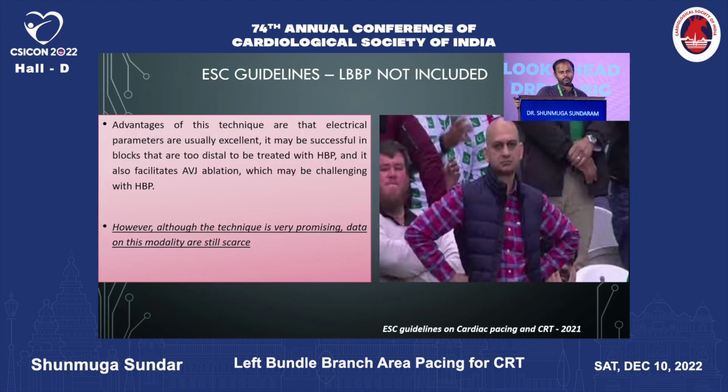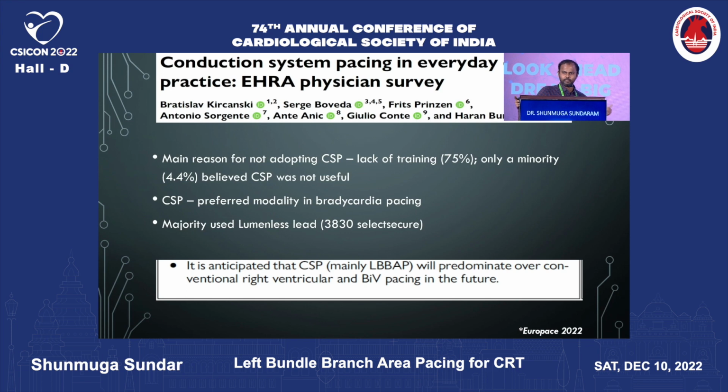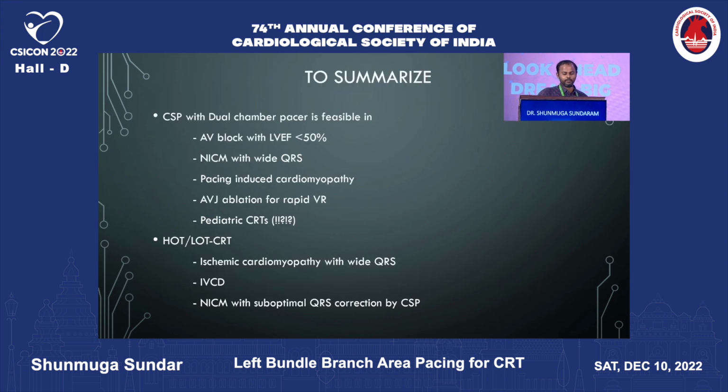ESC guidelines: there was a little disappointment with the ESC guidelines in 2021. They say they have praised left bundle pacing, but they said they are not going to give it a status as of now because of lack of evidence. But the future seems to be better. They have mentioned that with the increasing adoption of the technology and with the availability of randomized trials, most probably left bundle pacing will come into the guidelines. That is what we are seeing. At least a dozen randomized trials are already in, and this was the latest EHRA survey published last month in Europe, where they have shown that it is anticipated that CSP, mainly left bundle branch area pacing, will predominate over conventional RV pacing and BIV pacing in future. So definitely the future seems to be better.